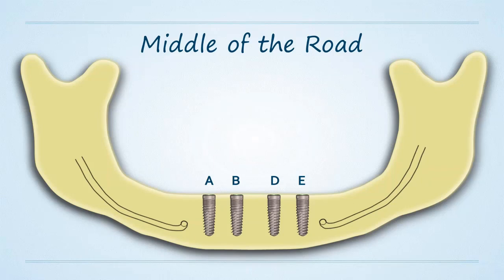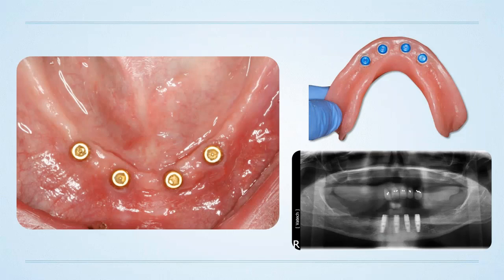Now, yes, if you're paying $400, $500, $600 for a dental implant, that might be a concern. But looking at a more affordable type of implant, like a legacy implant, yeah, adding 2 more implants is a really awesome value add for your patients. So what I found from my experience in my practice is this is what I do a lot of these days. I put in 4 implants in the anterior mandible, somewhere between the A, B, D, and E positions approximately.